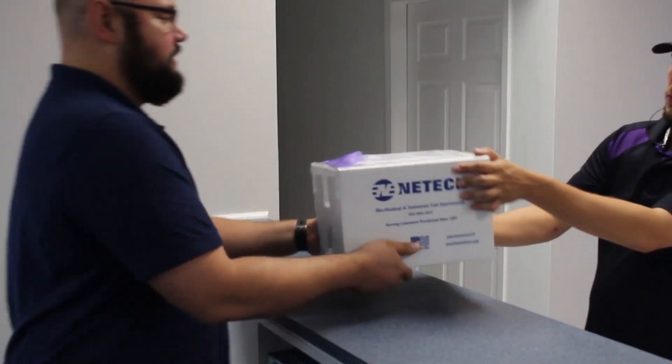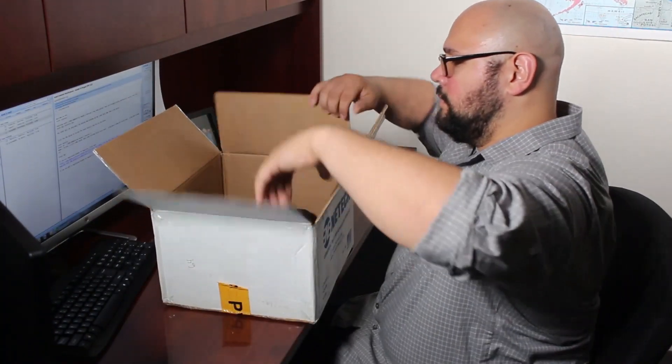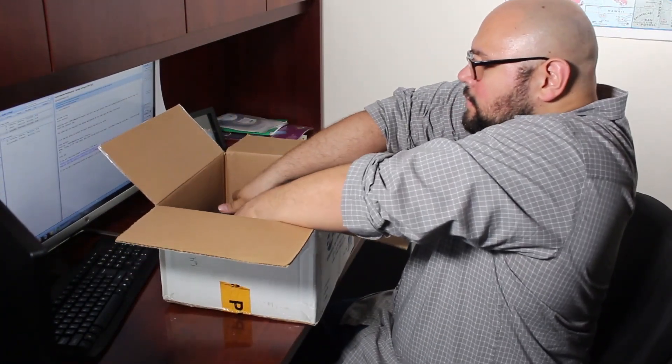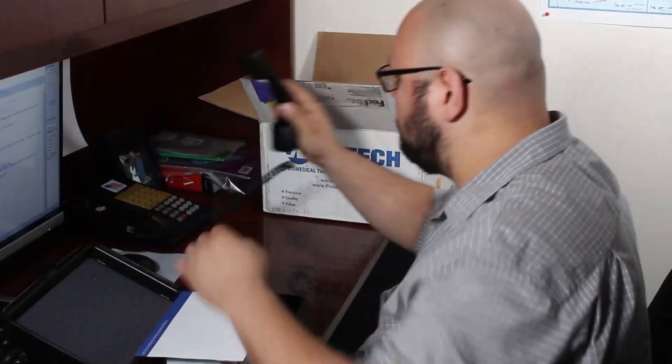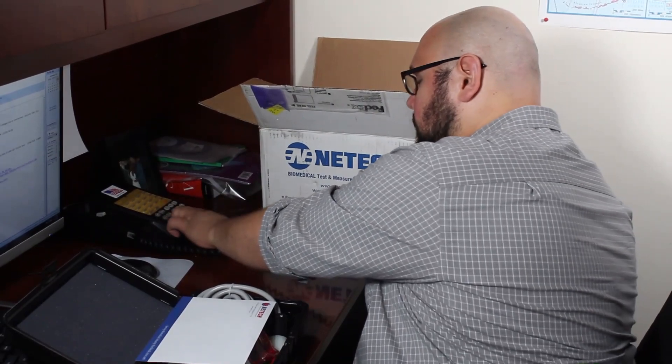Upon receiving the package, inspect the shipping box for any visual damage and confirm if all contents have been received in full. If any damage to the unit is observed, please contact Netech customer service immediately.